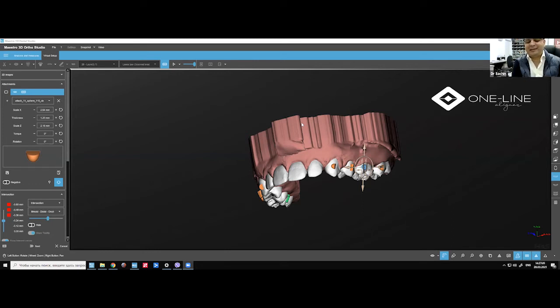The only problem with negative attachments is that printing errors might come up when you make the sheet. For example, you have made a 1.2 negative attachment, but in the sheet it will not be 1.2. It might be 0.2, 0.3. That's a big problem. You have to find exactly how much you want it to go inside. Maybe this will be better in the future with printing. Yes, with the printing it will be pretty good.